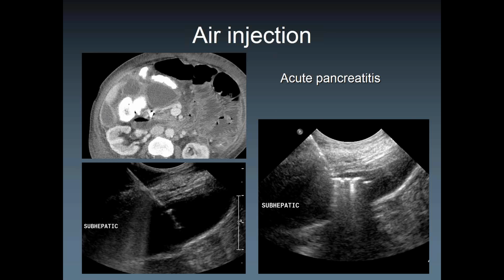Okay? In this case, you can either fire a full core, which you usually don't do, or you just do nothing and tell that it's coagulated blood. Okay? But pus, you should be able to aspirate. Of course, keeping in mind that if you use a too small needle, then this test will fail, right? So for aspirating an abscess, you want to use at least 20 gauge to have a large enough introducer or needle to aspirate the thick fluid.